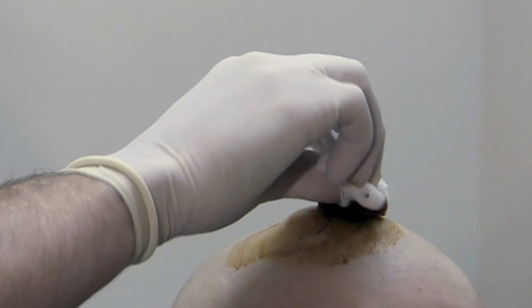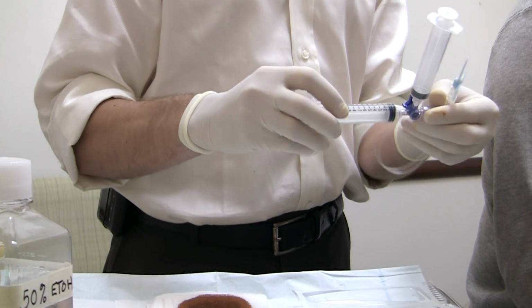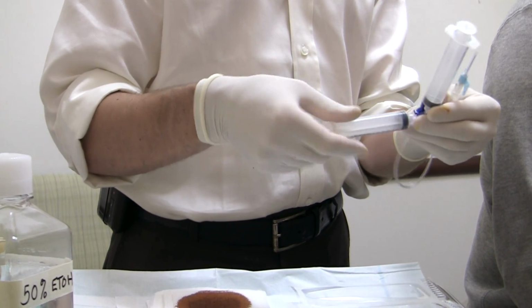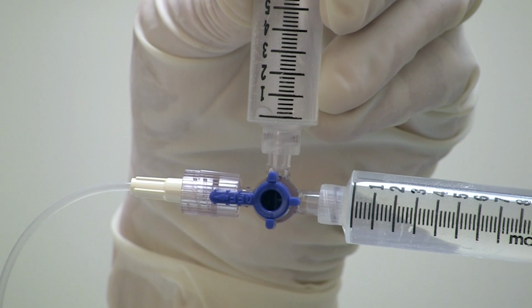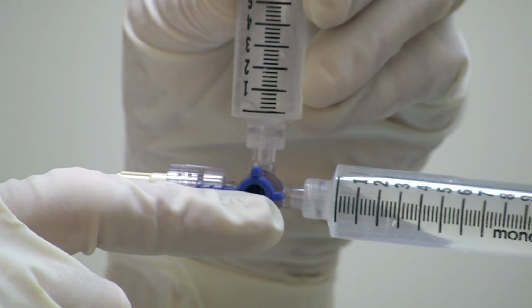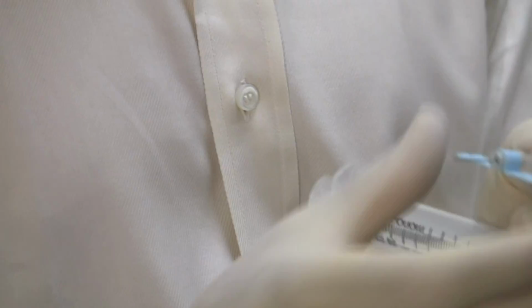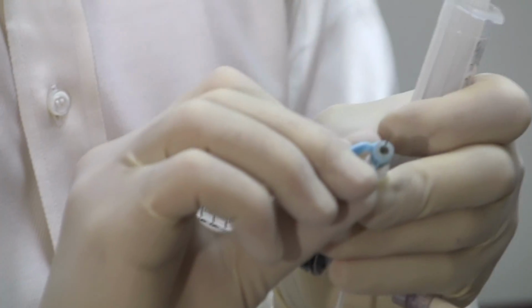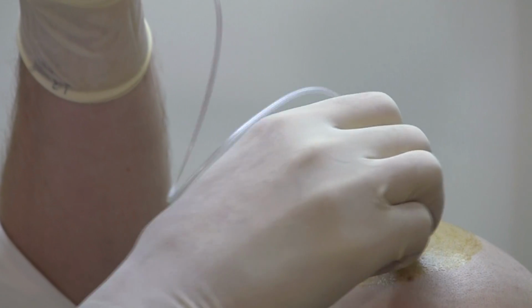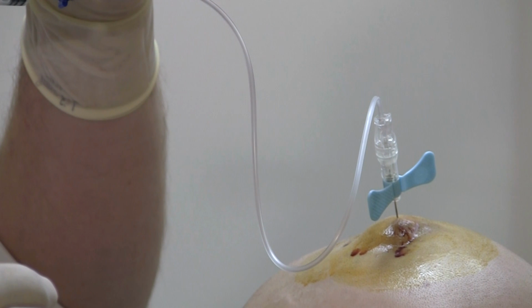Thoroughly clean the skin overlying the reservoir with sequentially smaller applications of betadine. Connect 2 10 cc syringes to a butterfly needle using a 3-way stopcock. This stopcock allows for differential sterile flow through each syringe. Use the smallest available needle, such as this 25 gauge butterfly. With one quick motion, pass the needle through the skin, the silicone reservoir, down to the hard plastic backing below.